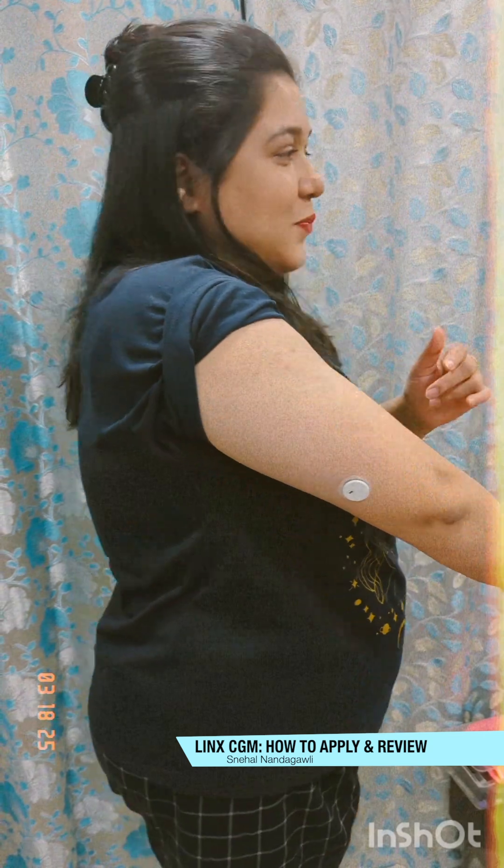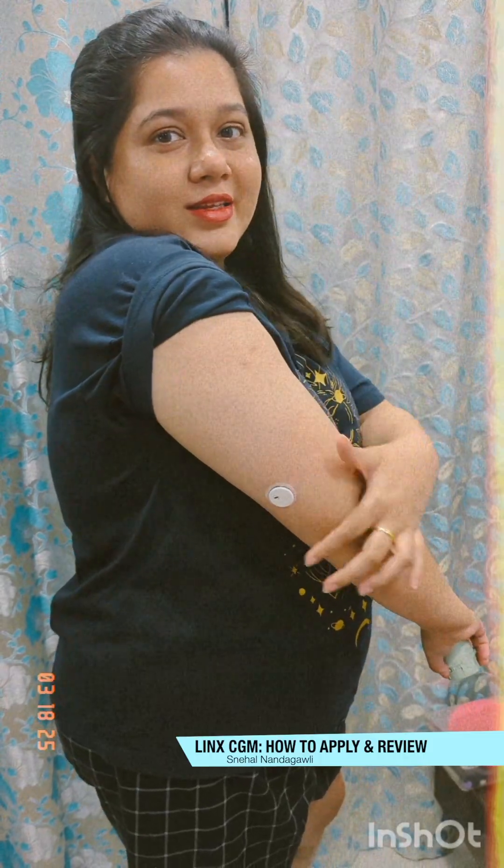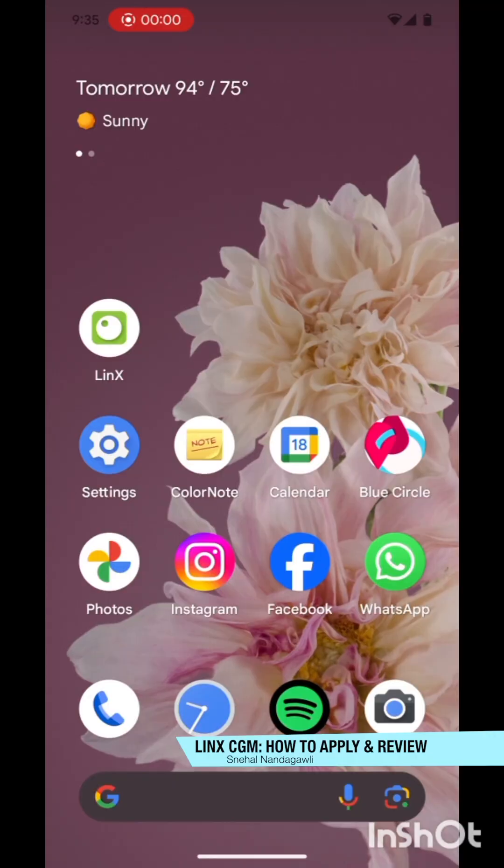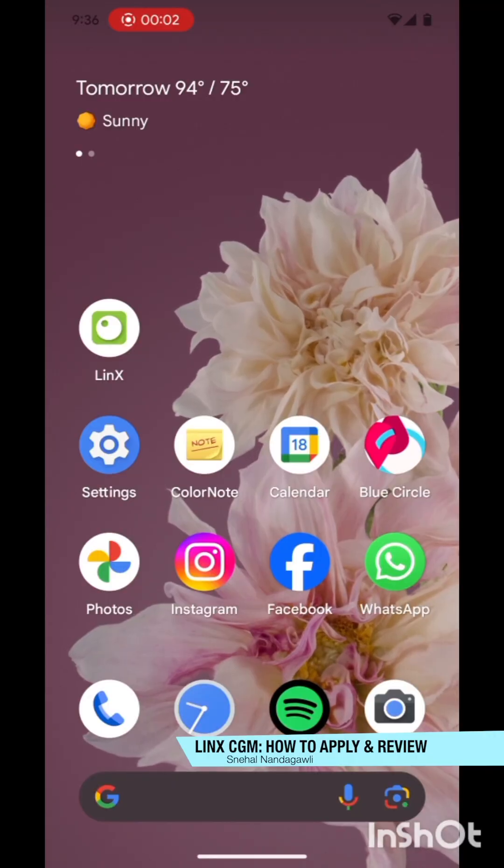It's a little surprising because I've always been using the Libre Pro, so I'm used to that size, but this is quite tiny. I think we are good.